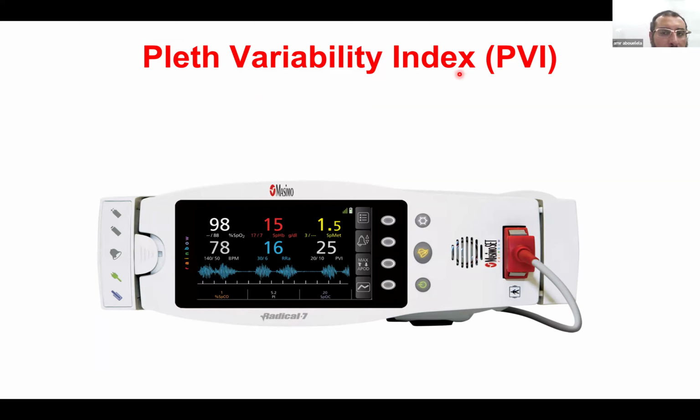I'm not focusing too much on this because all the studies mention that the validity of these devices in the critically ill patient is not well validated, and it's not recommended to use in the ICU, but it can be used in the rapid response team for an initial quick assessment of whether the patient may be fluid responsive or not. But they are not good tools in the ICU, you should go with a more invasive monitor.